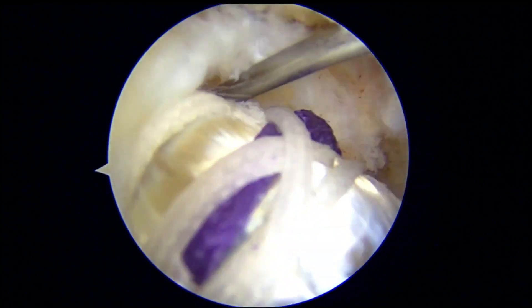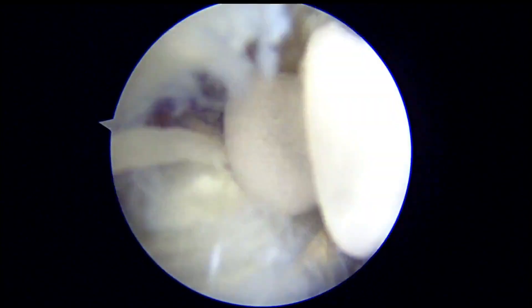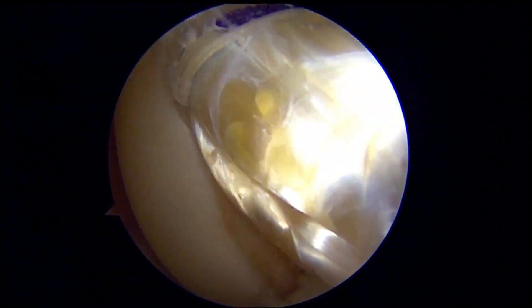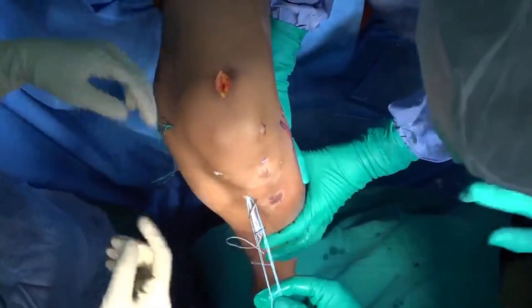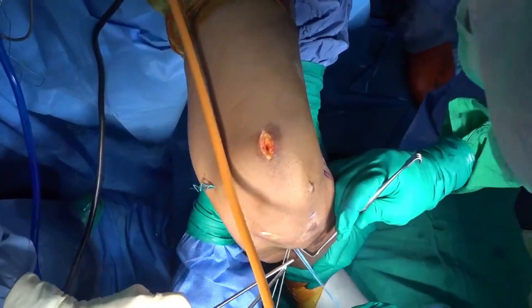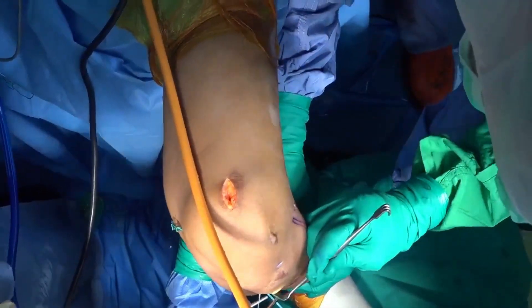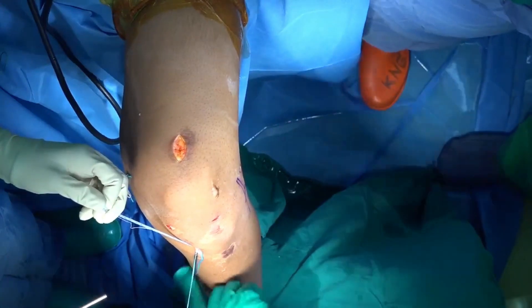Pre-tensioning is performed. The ideal placement for the screw is on the posterosuperior side of the tunnel. This screw position is intended to push the graft anteriorly. We will use a screw size of 6 or 7 mm with tapering before bioscrew insertion. The viewing camera can be moved back to the posterior to visualize the graft. Next, the graft is tightened towards the tibial tunnel. We use a button extension as a precaution. The graft is tightened in a 90-degree flexion position with anterior drawer. The securing suture knotting was performed.